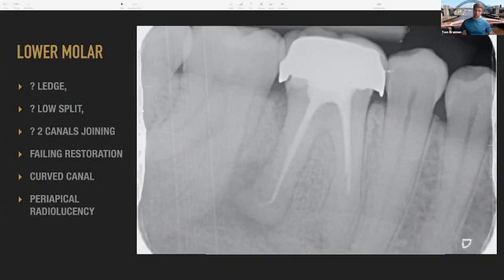But then also we've got some short obturation in the mesial canals. Looks like an initial quite severe curvature in the distal canal, but we've definitely got some missed anatomy. So is there a reason why they've not been able to obturate the 2 mesial canals? Often in lower molars, you'll find that the mesiobuccal and mesiolingual join. Sometimes I think, well, actually, is that what's happening here? Is it the fact that these 2 GP points are bumping up against each other, or they create a ledge?